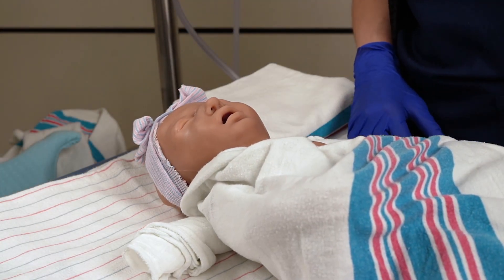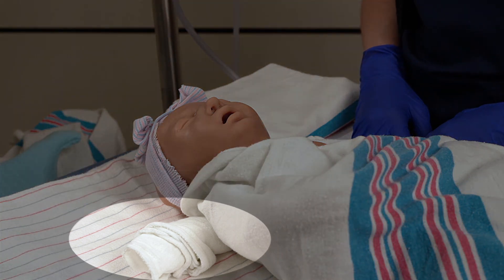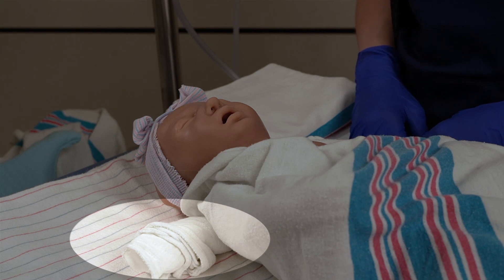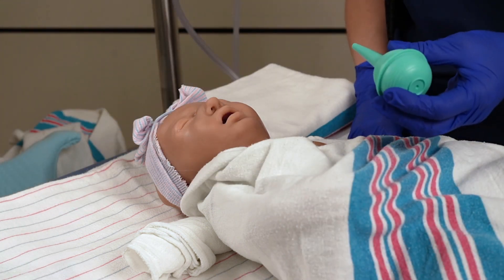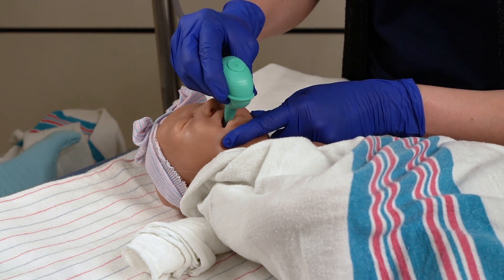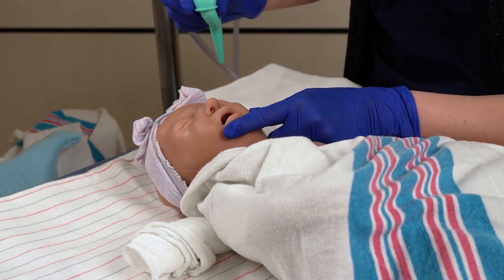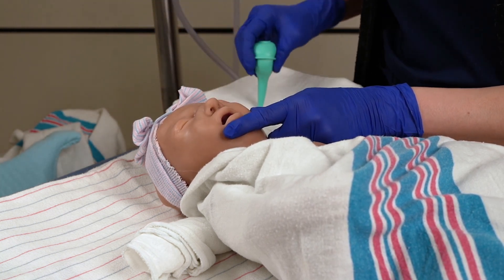Position the infant supine and swaddle to promote comfort during suctioning. Position the infant in a sniffing position with a roll behind their shoulders to open the airway. Use a bulb syringe to clear the mouth or nares of secretions — first gently suction the mouth, then the nares. Discard secretions by squeezing the bulb onto a towel or blanket.